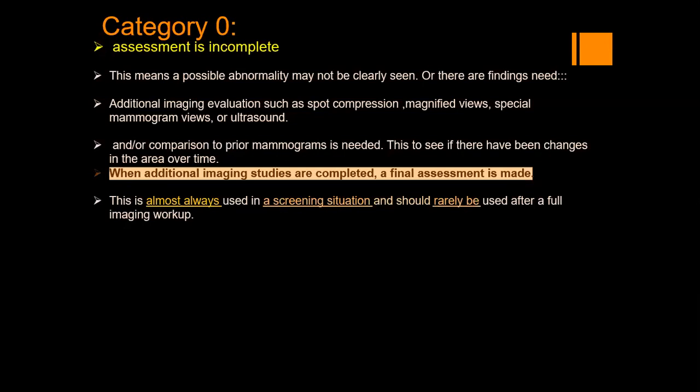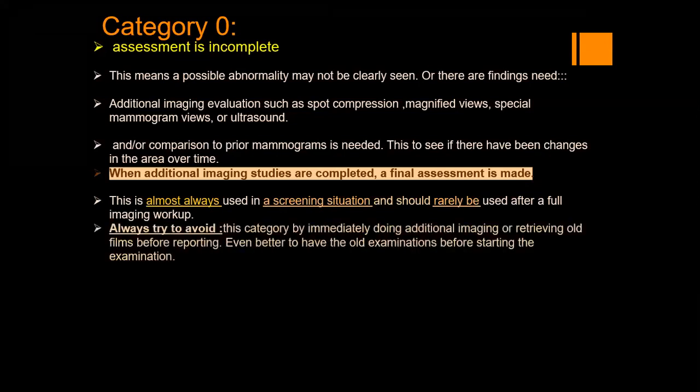This is almost always used in screening situations. Sorry, it should rarely be used after diagnostic workup or in diagnostic mammography. Why? Try always, in diagnostic mammography, to prepare the prior studies before starting your new mammography. So it will help you. But there are certain situations we'll talk about in which we can use BIRADS 0 in a diagnostic setting.